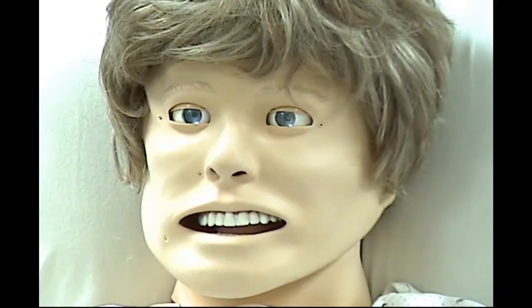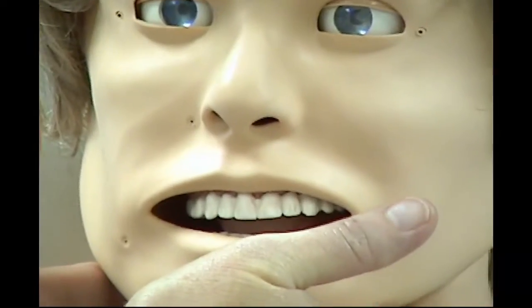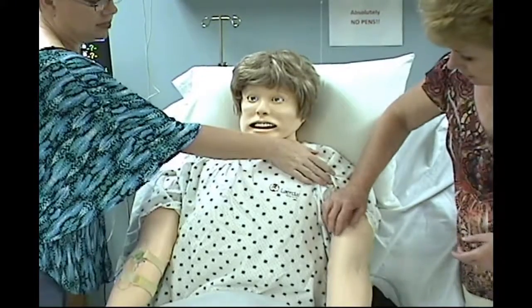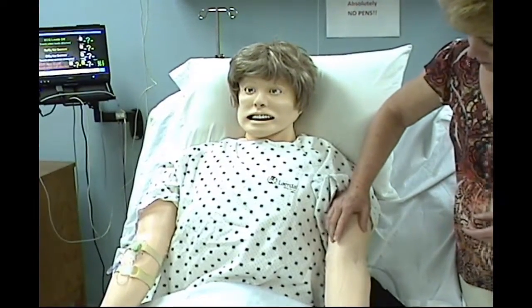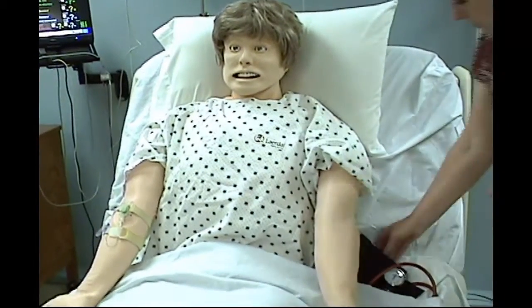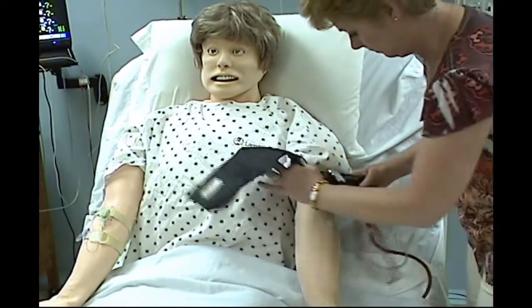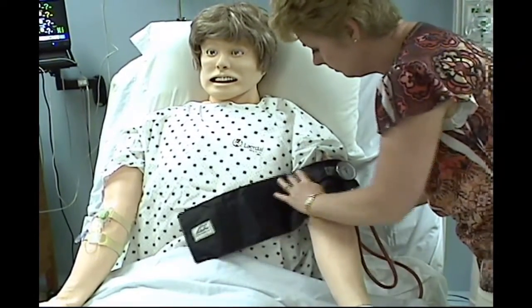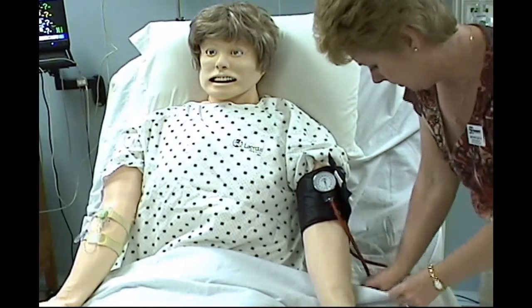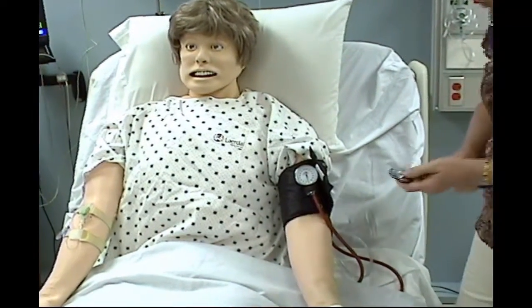The simulator also has bilateral carotid pulses, and a brachial pulse may be palpated in the upper aspect of the left arm. You may also obtain a manual blood pressure by placing the cuff on the patient's arm and placing your stethoscope at the antecubital fossa.